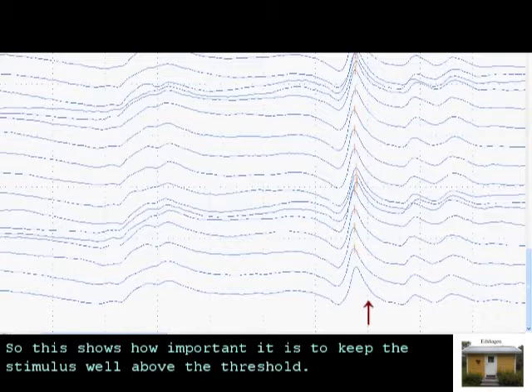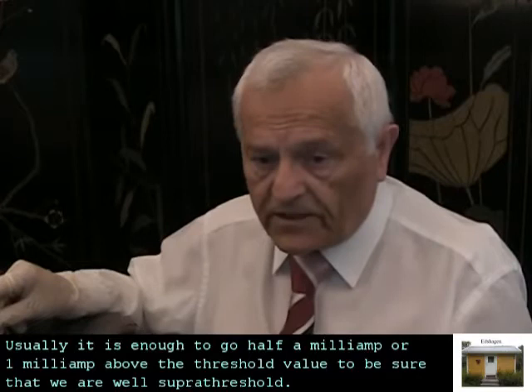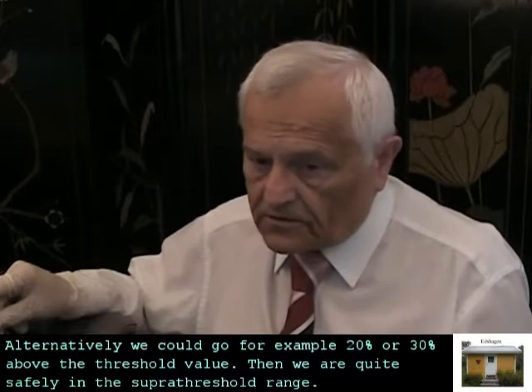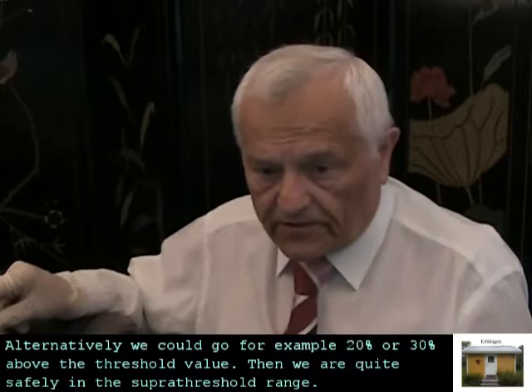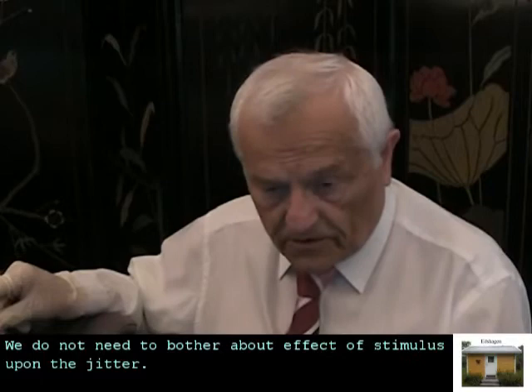This shows how important it is to keep the stimulus well above the threshold. What does 'well above threshold' mean? Usually it is enough to go half a milliamp or one milliamp above the threshold value to be sure that we are well suprathreshold. Alternatively, we could go 20% or 30% above the threshold value — then we are quite safely in the suprathreshold range and we do not need to bother about the effect of stimulus strength upon the jitter.